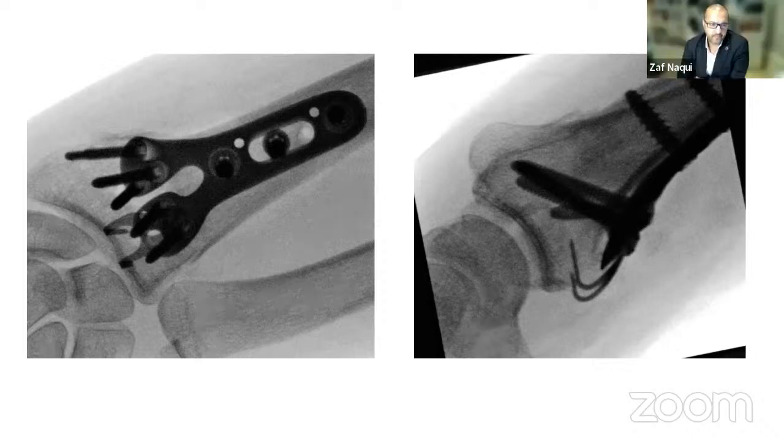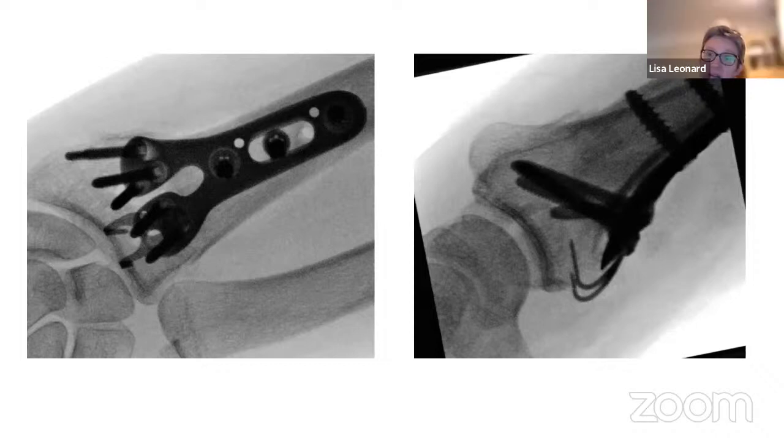Yeah. So this is a canny little thing they've got on there, which has got some little pins in, which you drill into the volar lip fragment. And then you screw that, it goes into a little plate, a hook plate, and it screws in. So it's a nice little extra thing. And it's not as distal as the volar rim plate, which Synthes make, which is really quite clunky and thick and you nearly always have to take it out. And we have used both. There's an example of both in the pack, but this is a neat little solution and a really nice reduction that my colleague Mr. Ray got. So I haven't used this yet. It's quite new, we've only started using the radius plate for a while, and you don't need it that often, but it's another little thing in the armory.